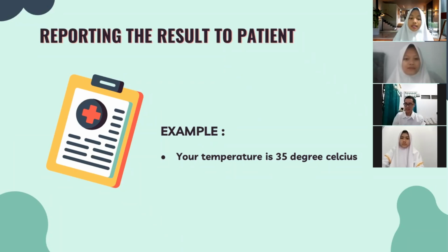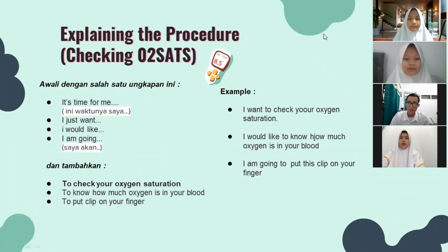Okay, thank you, nurse. Temperature checking has been completed. The next procedure will be delivered by Farah Hasna. Okay, the next topic is the procedure of checking oxygen saturation.